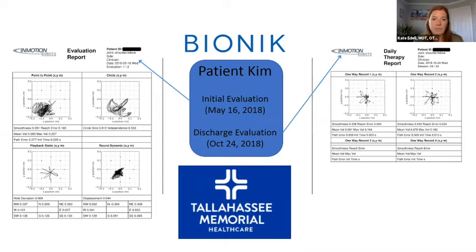Absolutely. Tell us a little bit about this patient. Yeah, like I said, he is a kid, so he gets really excited thinking this is kind of like a video game.